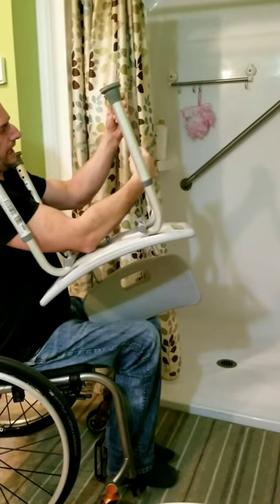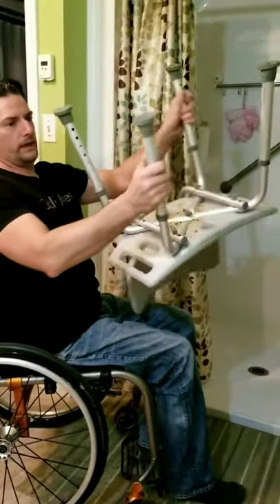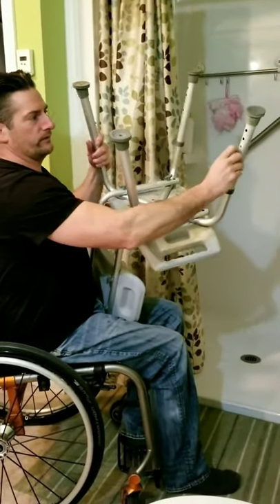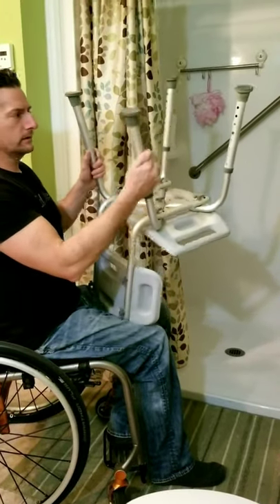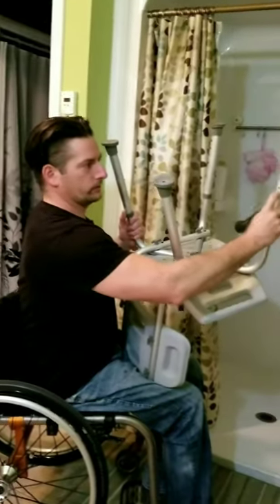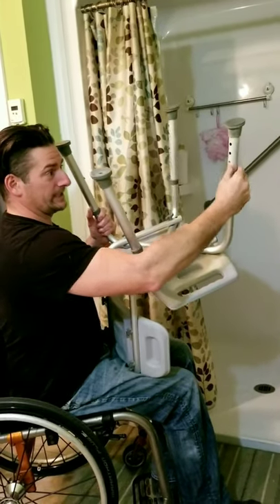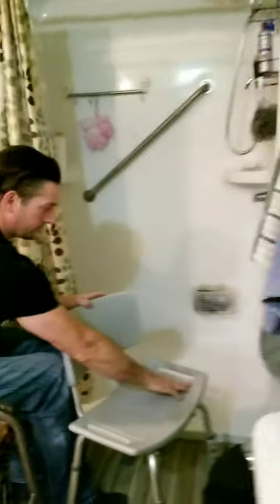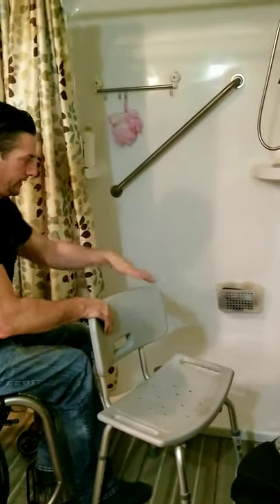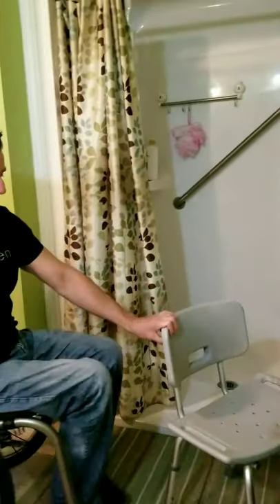When you're doing your bath bench maintenance and cleaning, you want to take these tabs off and clean them too, because they will eventually rust. I had one bath bench years ago where I didn't maintain it, and the tab actually rusted. One day I transferred onto it and it just snapped — the whole front end collapsed and I slid right off into the shower stall. So definitely keep those clean.